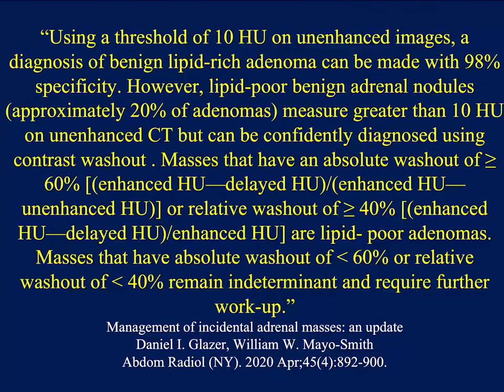with 98% specificity. Now, of course, we often don't have scans that are non-contrast because most of the CTs we do are going to have contrast, be it arterial phase or venous phase. And then we talk about looking at washout values. Benign adrenal lesions which measure, let's say, 5 Hounsfield units can enhance to 60 or 70 Hounsfield units with contrast. So if you only have contrast scans, you will overcall the significance of lesions. So again, non-contrast, if you want to look at an adrenal lesion, look with non-contrast. But if you have contrast, then we need to think about washout values.